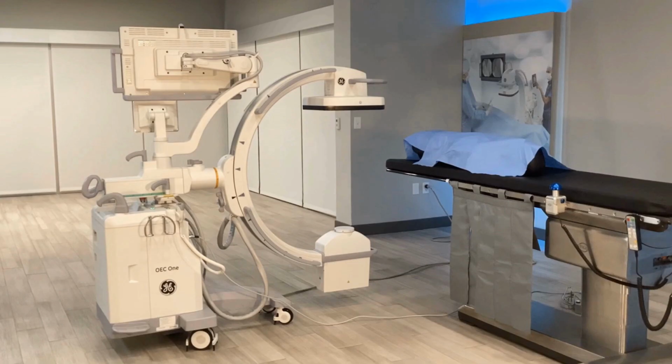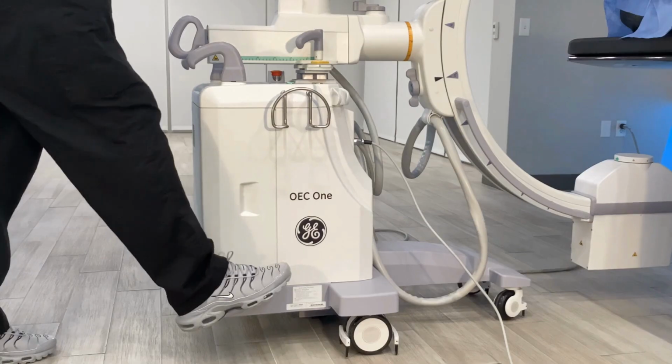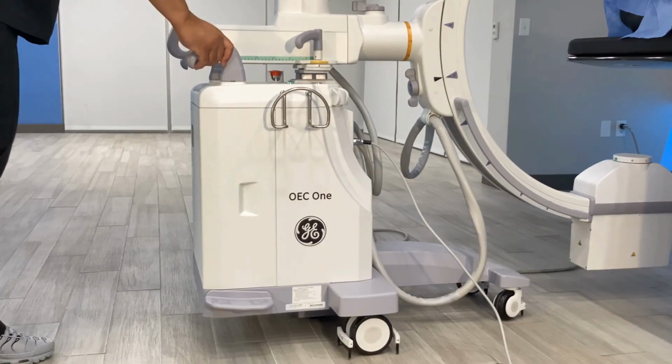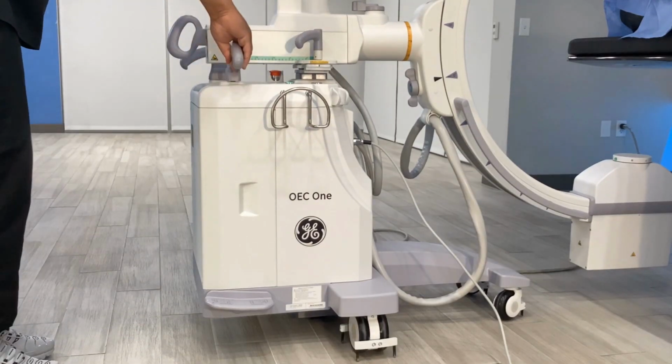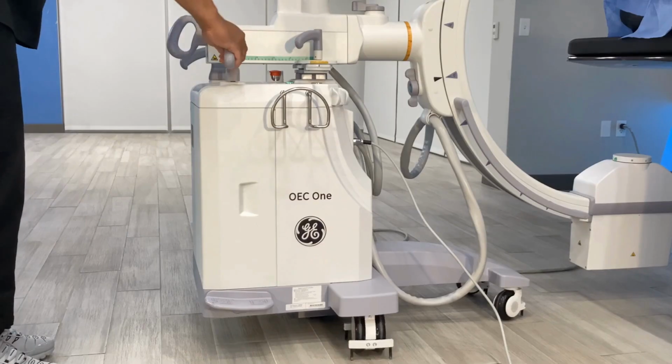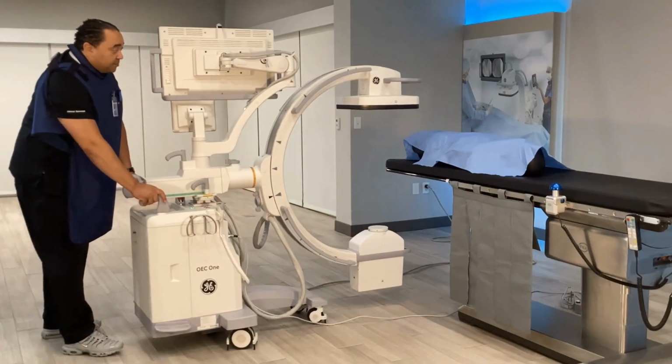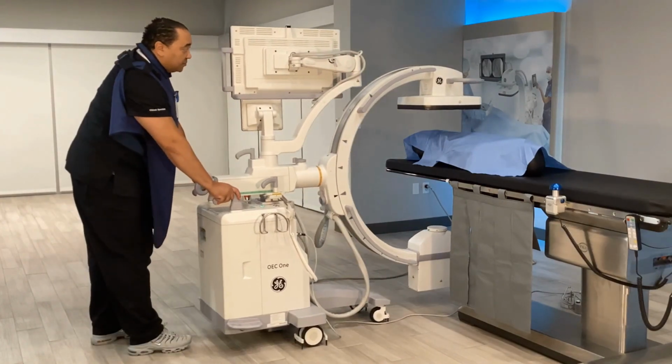This video will discuss OEC One CFD brakes. Press the brake to free position to release the rear steering wheel. The pedals are located on each side of the system. The right steering handle will turn the rear wheels to the right or left from 0 degrees to 90 degrees. Use this feature to position the C-arm during clinical applications or transport.